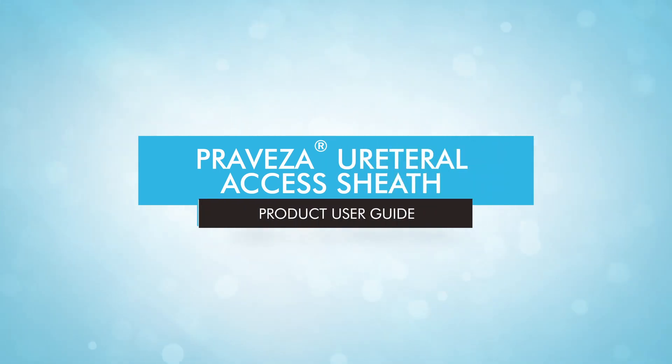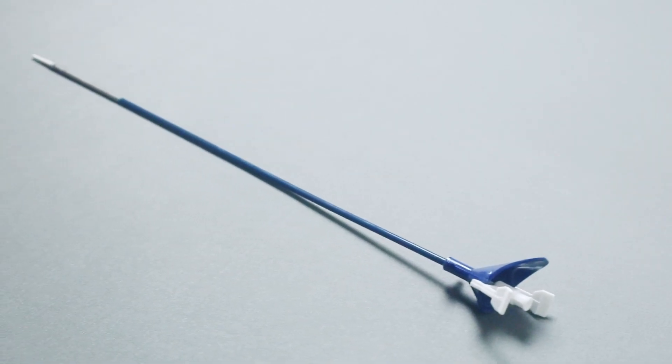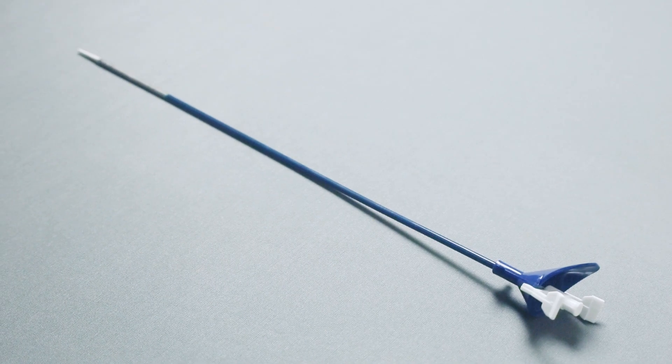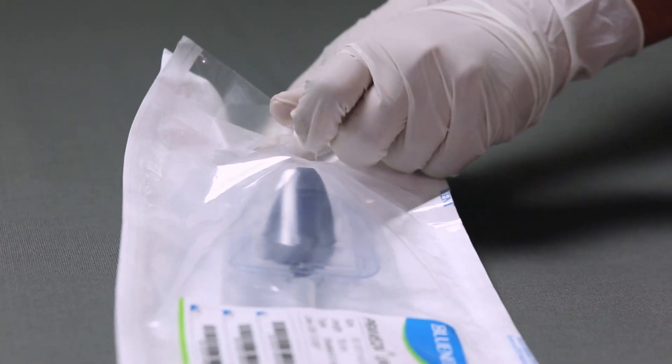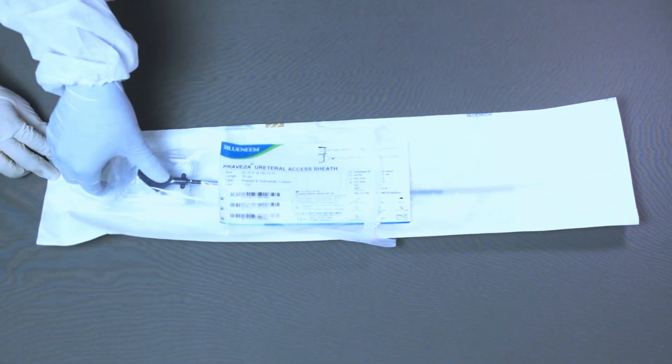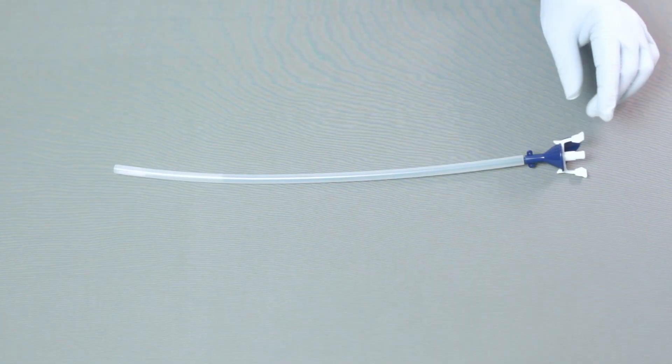The ureteral access sheath is intended to be introduced into the ureter to function as a dilator. It is used to establish a conduit during endoscopic urological procedures, facilitating the passage for ureteroscope or endoscope and other instruments into the urinary tract.